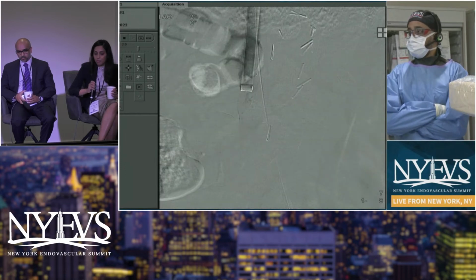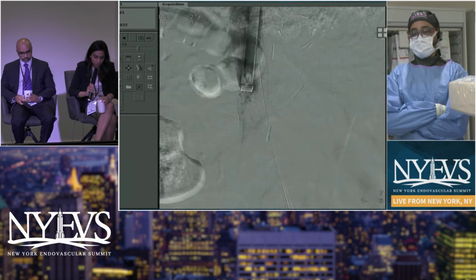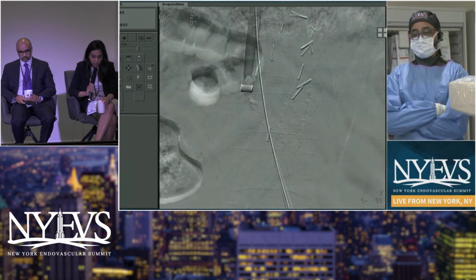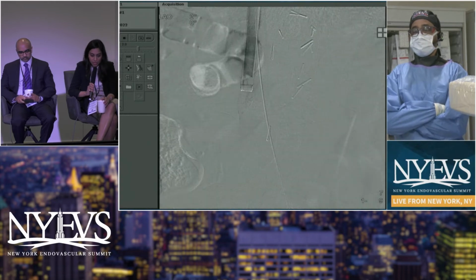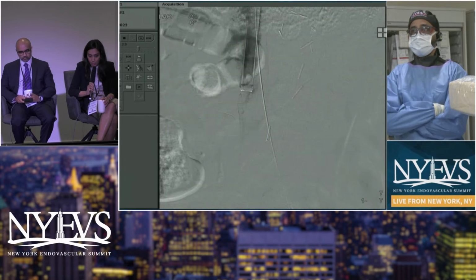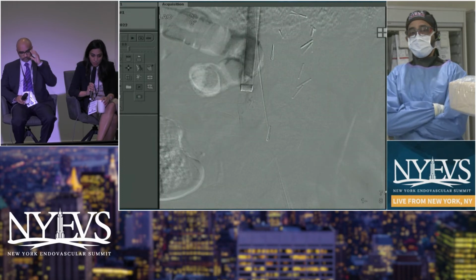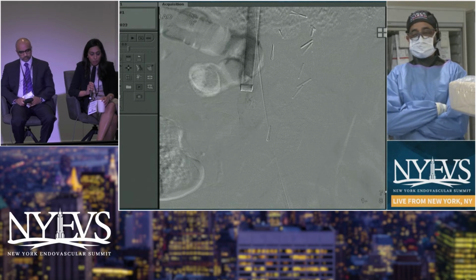Me too. So recently at UCLA, we've had a run of complex filter retrievals that did well intra-procedure and did well on the post venogram. Perhaps in one or two cases there was a contained perforation that was managed with ballooning. And the patient was in the PACU for 2 hours before suddenly dropping pressures, becoming hypotensive, and was brought back to CT, then back to angiography, and essentially needed covered stent graft placement.